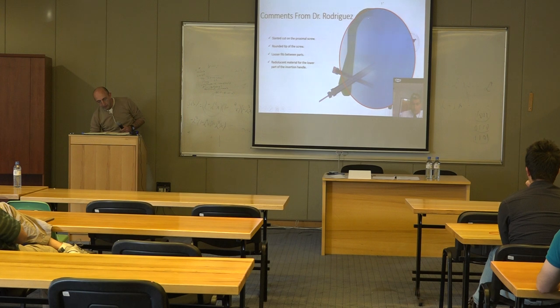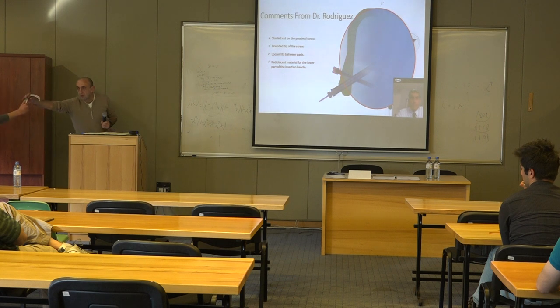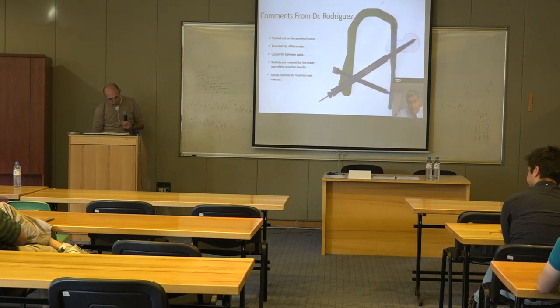Then, as Ara mentioned, they use X-rays during the surgery, and the suggestion was to make this part from radiolucent material, so that during the surgery it allows to see inside the leg. So this is not actual now, because we are concentrated on the nails themselves.